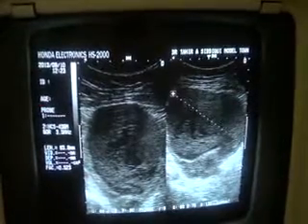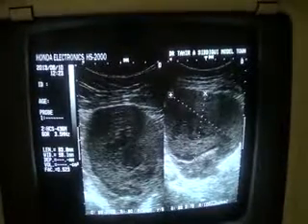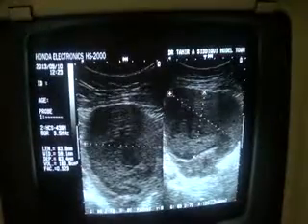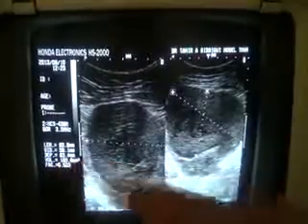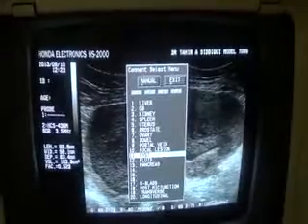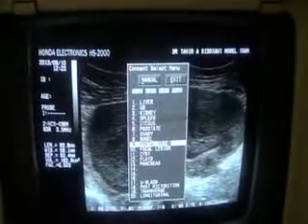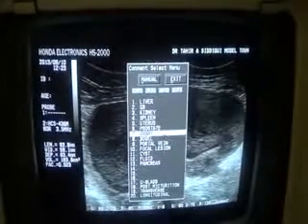And this is the longitudinal section of the cyst, and the cyst measures, again you can see the measurements, 9.3, 5.9, 6.3 centimeters, and its approximate volume is 183, which will be more than 200 ml when operated upon. So the three differentials come to my mind by seeing this.